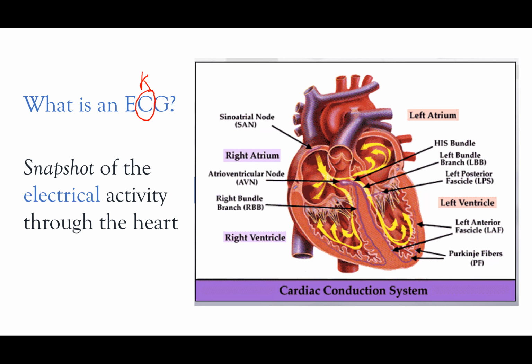And this is important because what we're trying to do clinically, most of us who are getting ECGs, is because we have a clinical concern. Maybe the patient is having a racing heart or palpitations or feeling lightheaded or having chest pain or trouble breathing. So we're getting an ECG in order to give us clues to their clinical situation, clues to their diagnosis. But what we have to understand is that an ECG is really just that. It's really just one of the tools that we use.